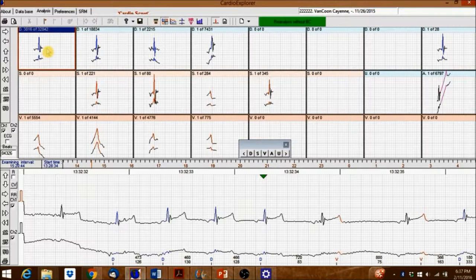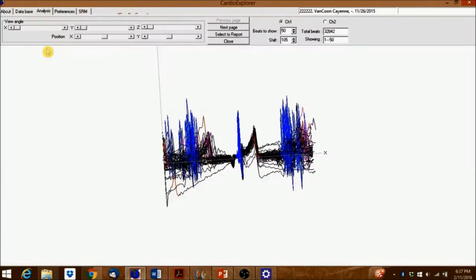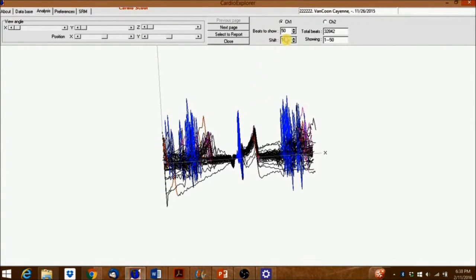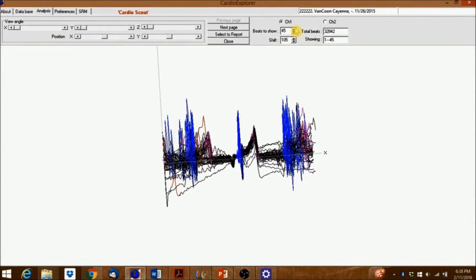Right-clicking into a box opens a sub-window that displays a 3D graphic of all the beats of that class. Here you can adjust the number of beats you want shown in the 3D graphic.